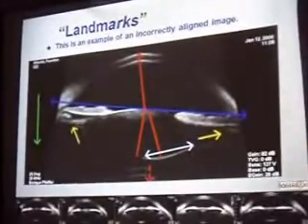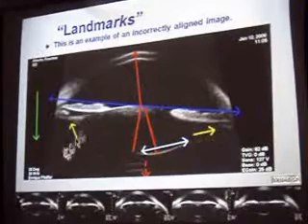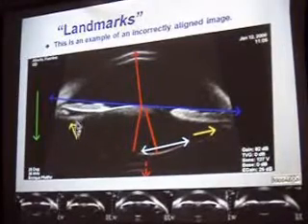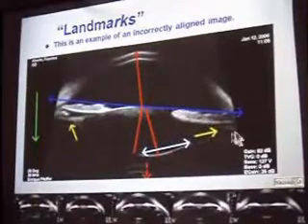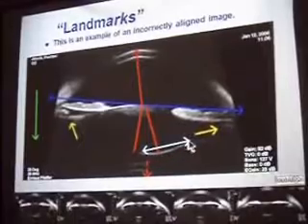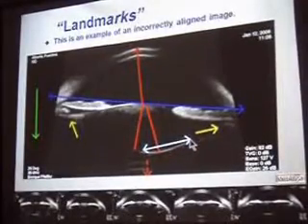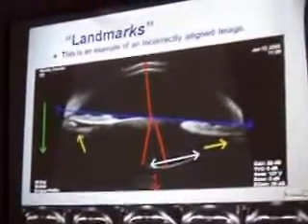Finally, a good sulcus reference seems to be pretty easy to understand. This is a very good picture, but it's not properly aligned. We have very nice details of the zonule over here, where we can identify the sulcus, but we cannot identify anything on the other side. And look at the posterior capsule. This is not the vertical parallax line. This line is completely breaking into parts.